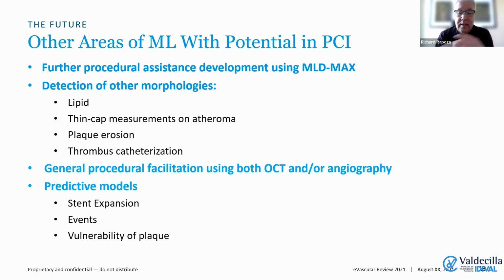So all of this is almost impossible to relate to real world outcomes unless we take care of the other side of the equation, which is data generation and data lakes that store outcomes in patients. Based on all of the pullback information that we have, this will enable us in the future to correlate all of this information and to have predictive models.